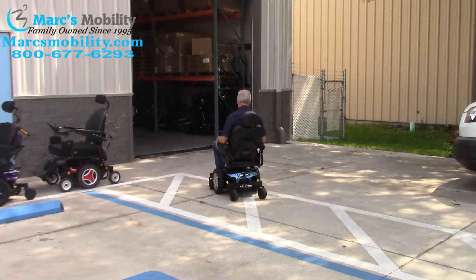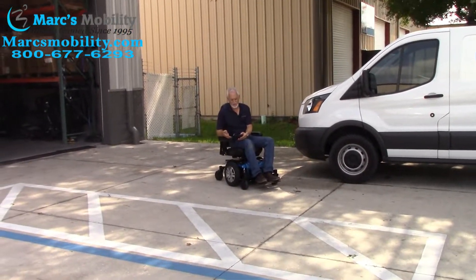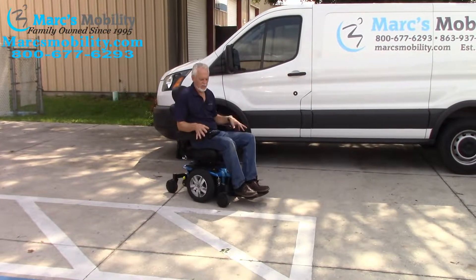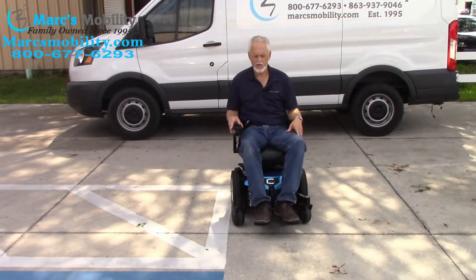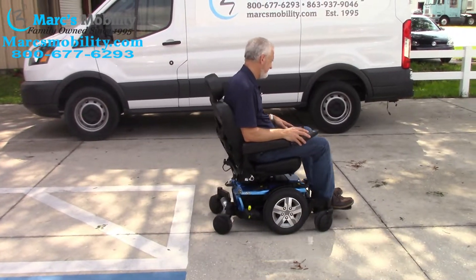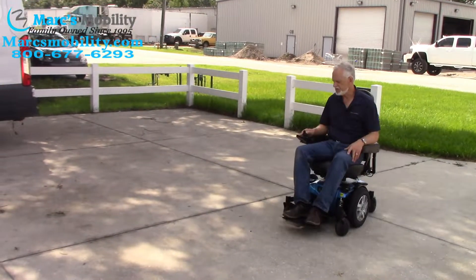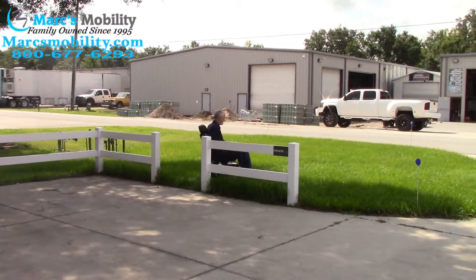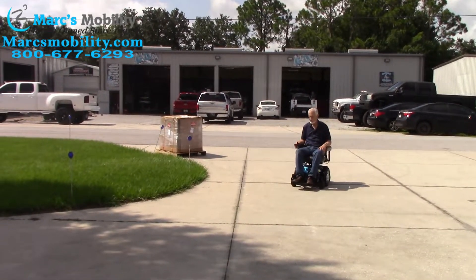This is the Quantum Edge 2.0 with a six-inch seat lift — very easy to drive. I can put this on speed number one; right now it's on speed four, which is six miles an hour. At speed one you can't get in much trouble learning to drive. I like speed four to give you the full speed. Interestingly, this chair actually picks up speed in the grass — instead of losing speed, it goes faster.